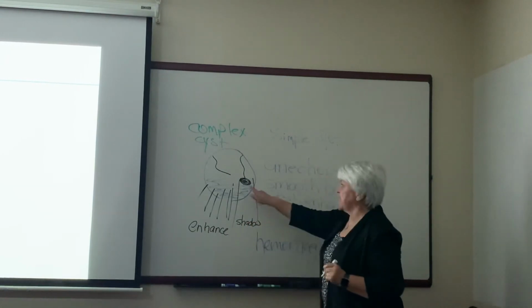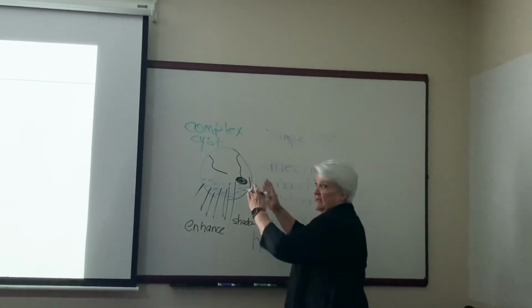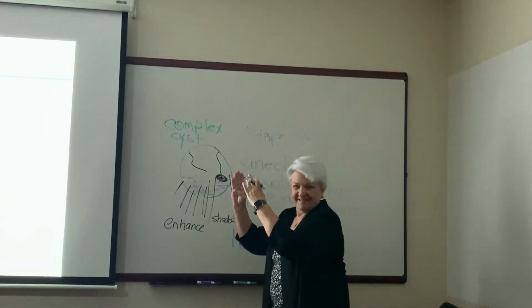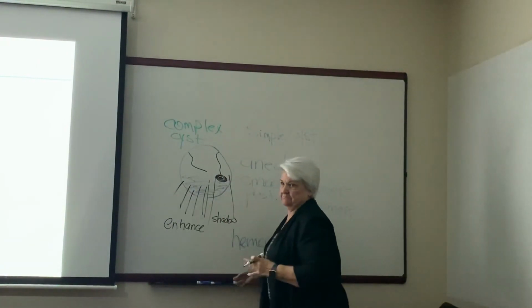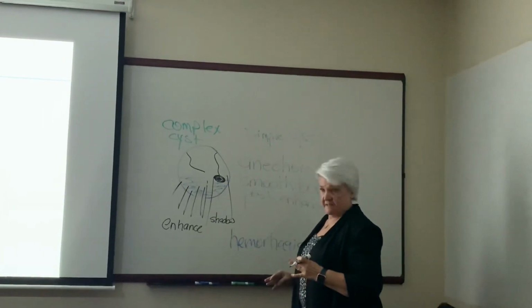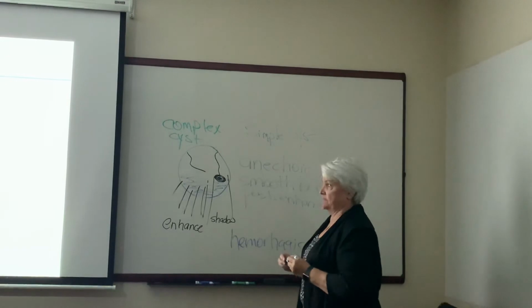Okay? See how there are no echoes? And it's always going to do this. Why? Because of physics. But calcifications show up bright, right? Bright. Okay. They show up bright.